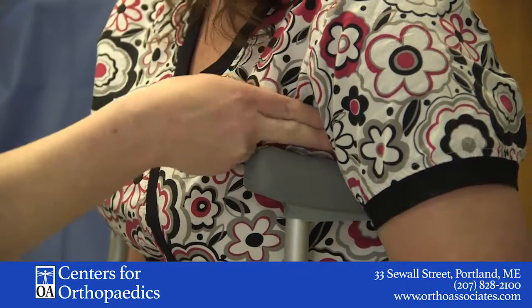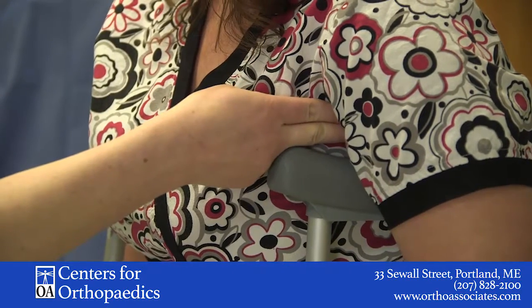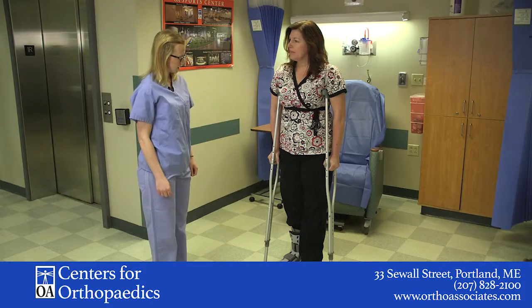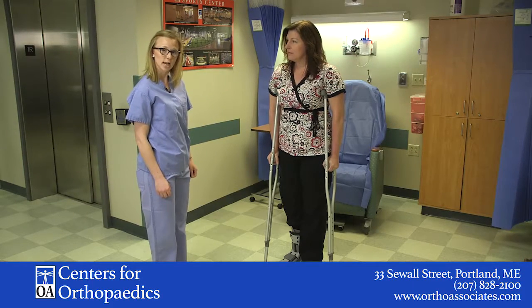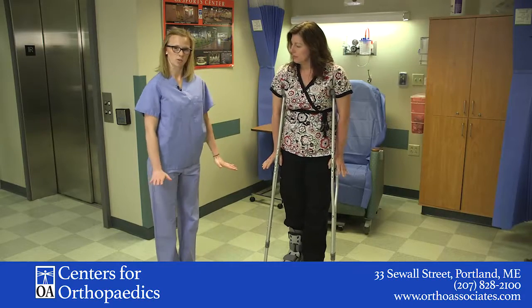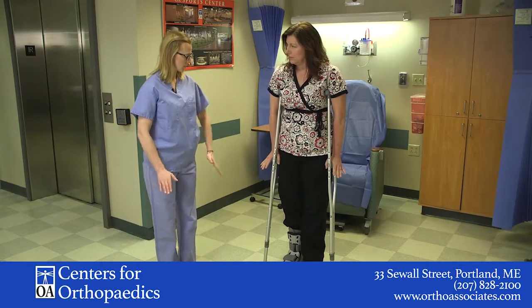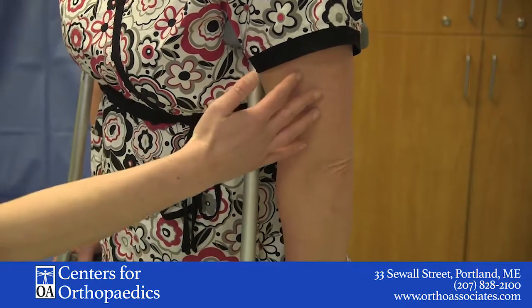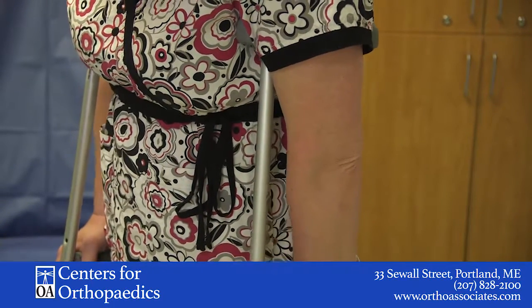How does that feel, Donna? Is that too much pressure in the armpits? You have a little bit of room? — I have a little bit of room. — Okay, perfect. So the next thing we want to look at is Donna's elbows. We want to make sure that her arms are not locked out straight — we want them to have a slight little bend. I would say we need to go up at least one on this because Donna's arms are pretty straight.